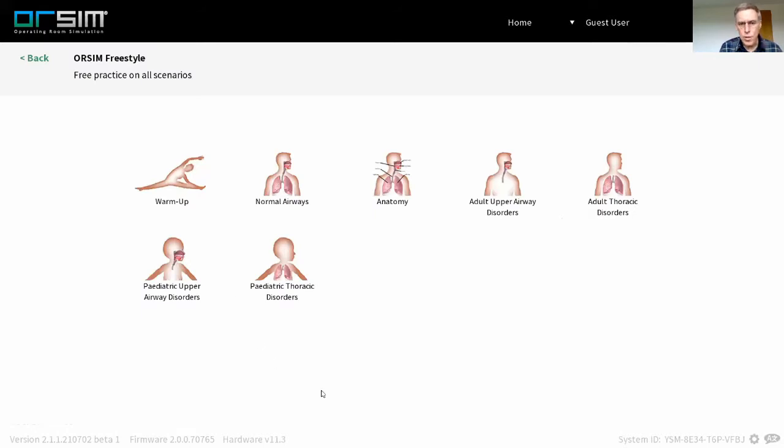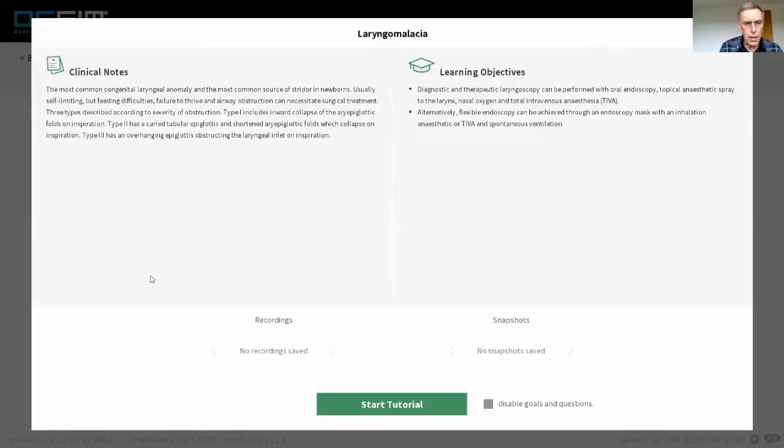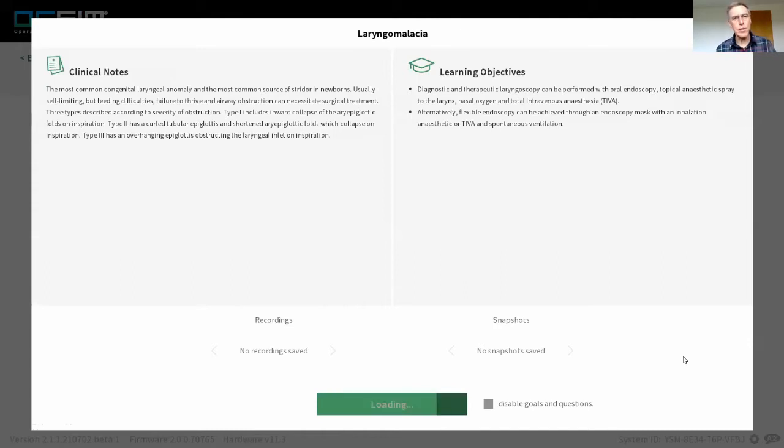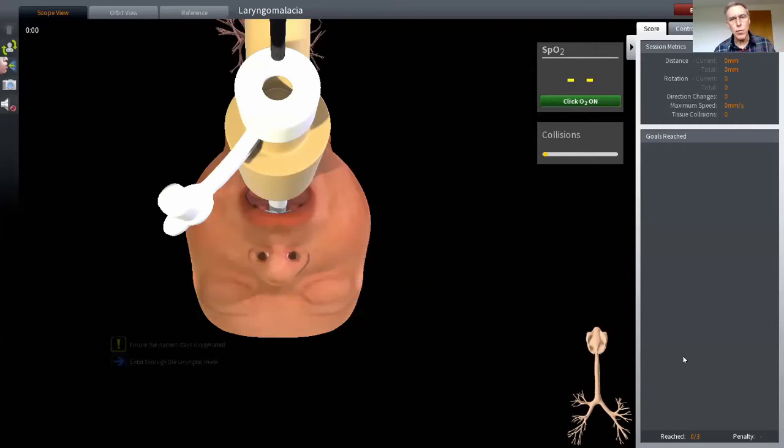There's a number of options that you could choose, but we're going to today deal with the pediatric module, and I'm going to choose laryngomalacia as an example. So we'll start the scenario, wait for that to load. It only takes a few seconds, and in the meantime, you can look at clinical notes and some teaching points.